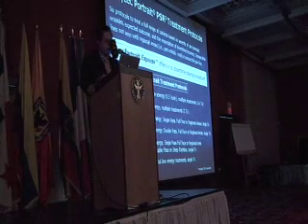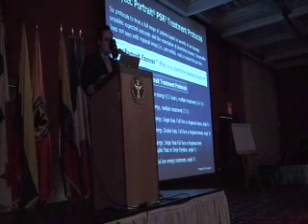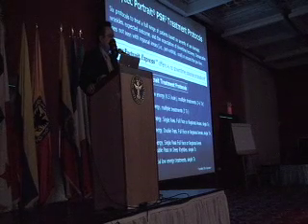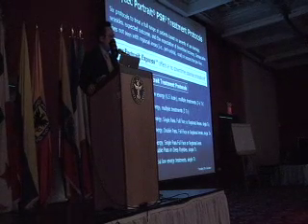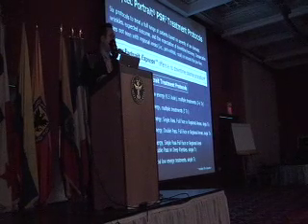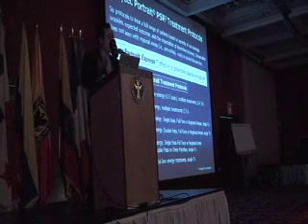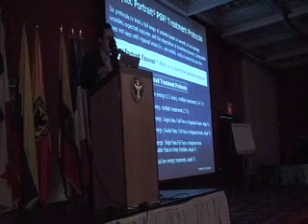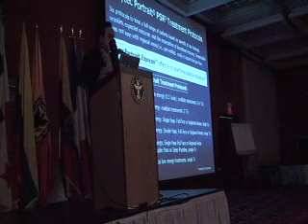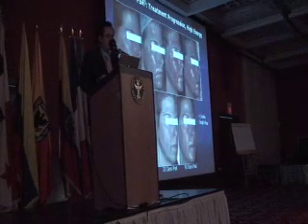These settings here are just to repeat one more time, because there's a lot of information I'm covering. I'm just trying to go through it one more time. Again, the Express is very low energies with no recovery. The PSR1 is a low energy setting that requires multiple treatments, is done as an in-office procedure. And the PSR2, PSR3s are high energy settings. One's a single pass and one's a double pass. And that does have the old skin fall away over a period of that week, and it comes back. That is a real recovery involved.